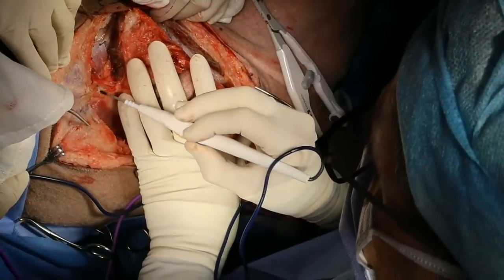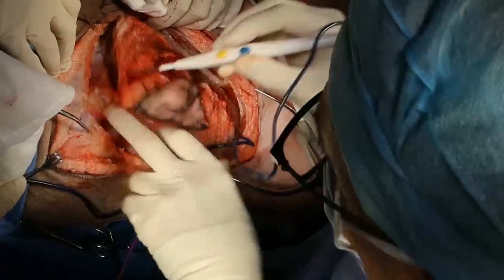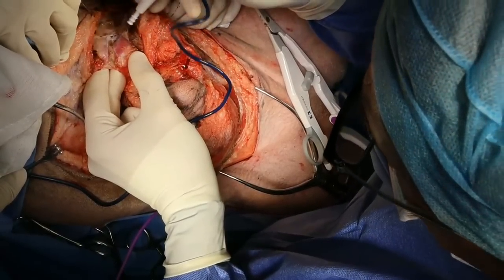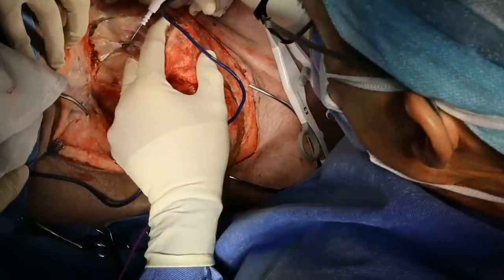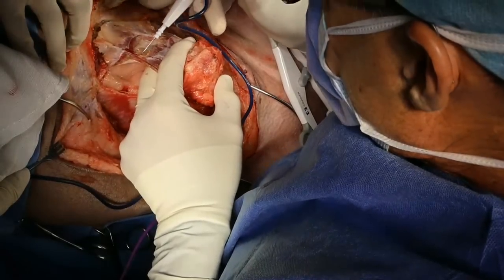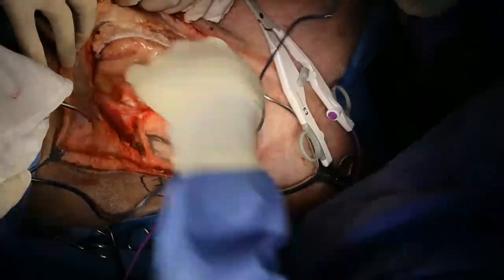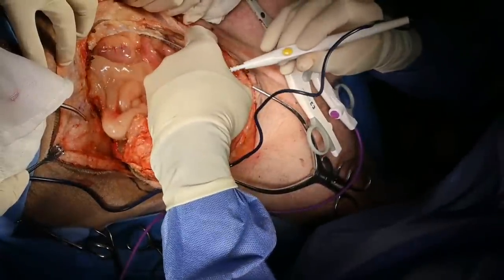All right, so now I'm just going to cut through the body wall up here as well. Am I into the abdomen? I believe I am. It feels like guts in there. So that's peritoneum that we're going through here. Intestine right there, and so we can palpate the extent of the mass inside the abdomen, and it's really big.